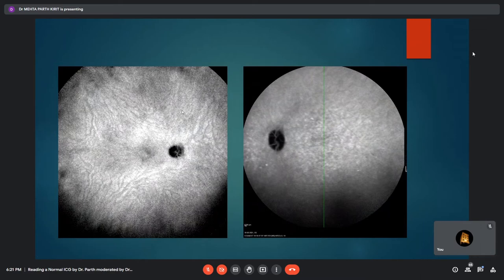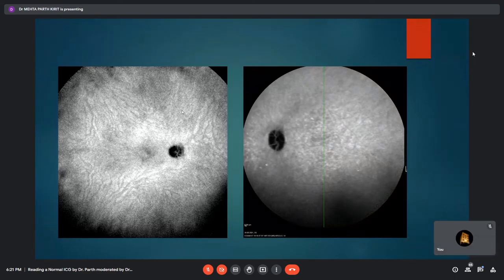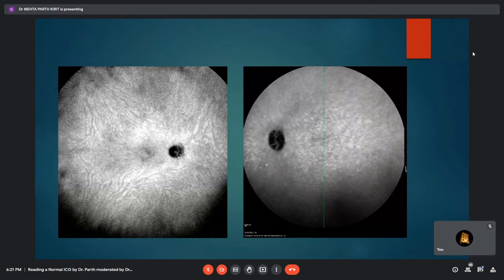A teaching point: which other investigation shows hypofluorescence of the optic disc? The answer is fundus autofluorescence. Hypofluorescence of the disc is very typical of both ICG angiogram and fundus autofluorescence. This is useful when you are not sure what investigation you are identifying — just look at the optic disc to tell them apart, since fluorescein angiography fills the retinal arteries while ICG also fills them, but the disc hypofluorescence is characteristic of ICG and autofluorescence.